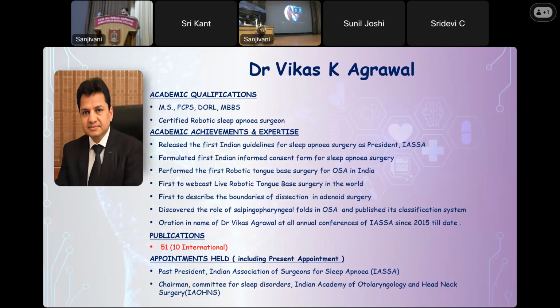And the sinus headaches, the whole frontal recess area is completely dilated. Obviously, it has selected use. It's not for every patient. Then you can do the same thing for sphenoid sinus as well. This is where we have already reached, right? You are inside the sphenoid, then you dilate. Just fast forwarding, and you open up the sphenoid pretty nicely and widely.